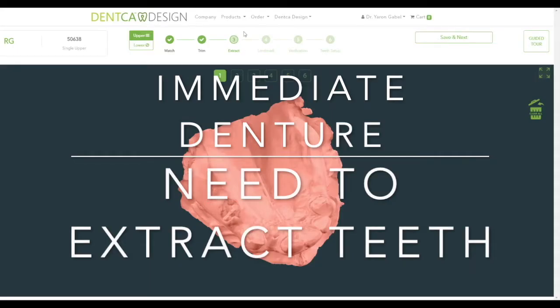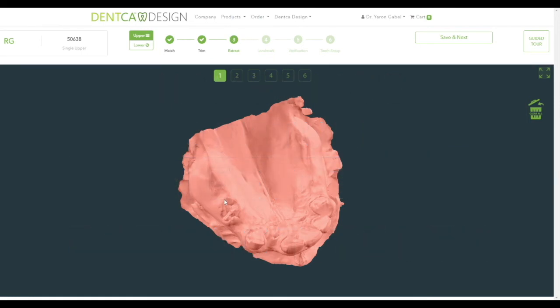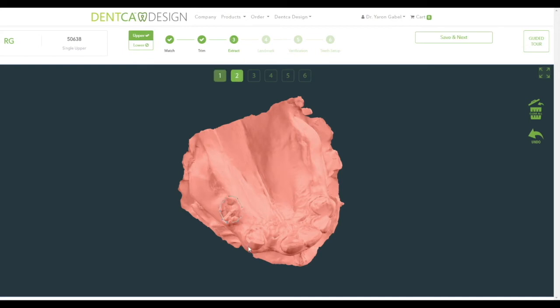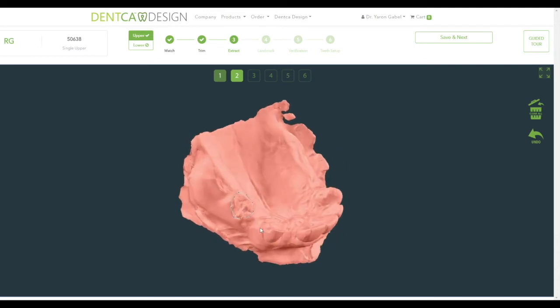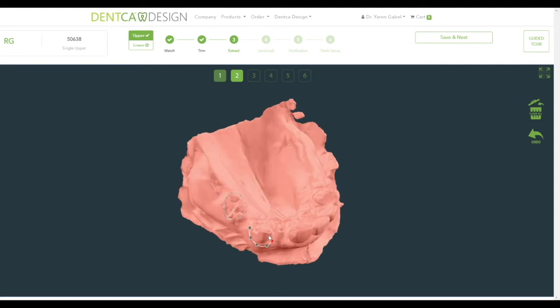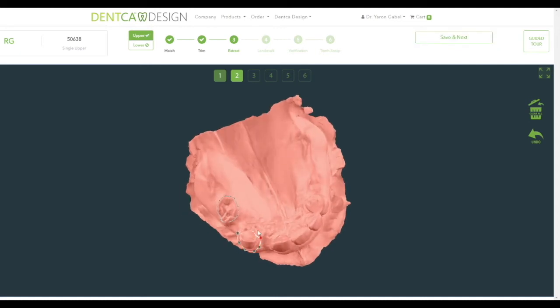Extract. If you selected an immediate denture during the initial data entry selection, an Extract step will appear at this point. Select the teeth or group of teeth that will be removed by creating dots around them in the same fashion as when you created a trim line. Then click on the following ascending number to draw a new line in a new area. Once done, click Save and Next to proceed to the landmark placement step. Please note that the teeth will not be removed until teeth generation.